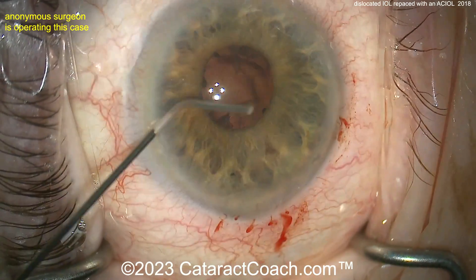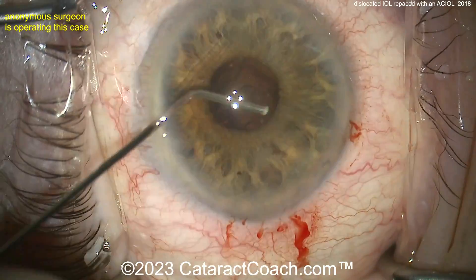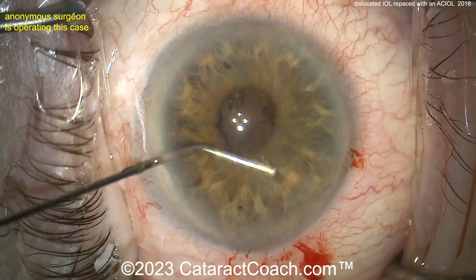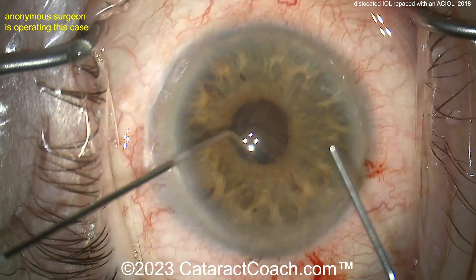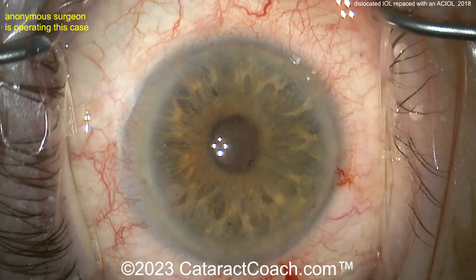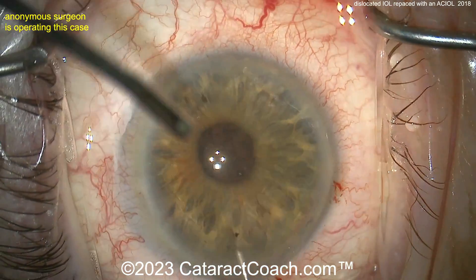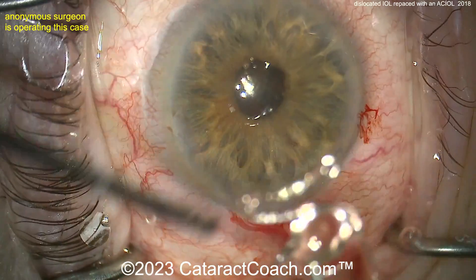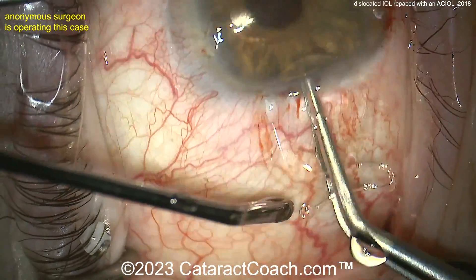Pulling that existing lens out — I usually like to place it on top of the cornea so I can examine it. You're certainly going to need to do some sort of vitrectomy and clean up here. The pupil came down nicely. A miotic agent is being instilled. You may want to put a little triamcinolone there just to see if there's any prolapsed vitreous, because I don't think the anterior hyaloid base is going to be fully intact here.